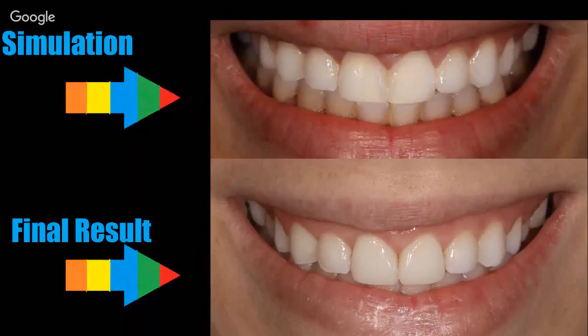So I'm performing the simulation on the software, and also I'm performing the composite freehand. This is not the case when you are just putting the template on top of the teeth in the simulation and then doing freehand clinically. So the simulation should usually simulate your clinical procedure. And that's why I would not recommend using the template when you want to show the patient the results of a composite restoration or of a gingivectomy. I do not recommend putting templates on top of teeth to show gingivectomy.